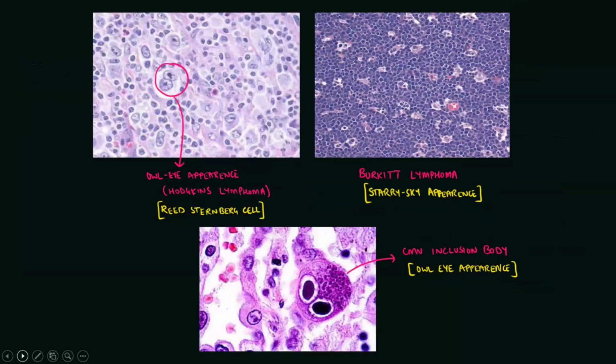Okay, so over here we have the next question. I think pathologists want to associate things with things, you know. They like animals, they like food. So here you can just remember it like that. Owl-eye appearance is seen in Hodgkin's lymphoma. And in the second slide, you see Burkitt's lymphoma. Burkitt's lymphoma gives a very starry sky appearance, and it is due to the apoptotic debris and numerous macrophages.